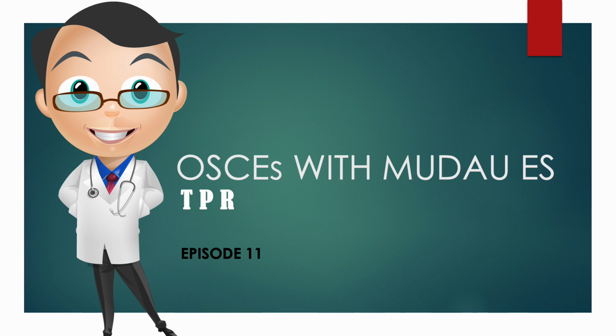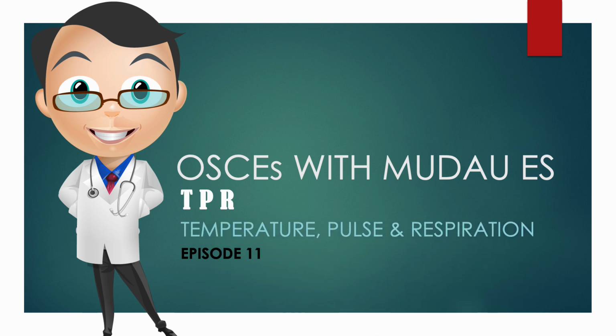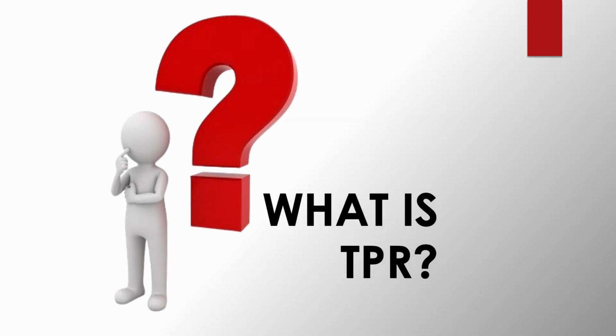Today we'll be doing TPR, which is known as temperature, pulse, and respiration. TPR is defined as measuring temperature, pulse, and respiration to make an assessment of the normal and abnormal functioning of the body.